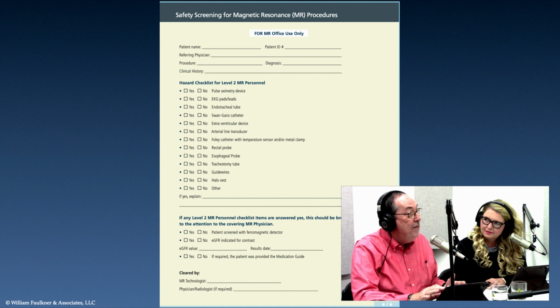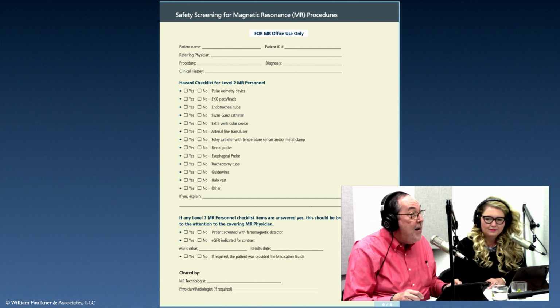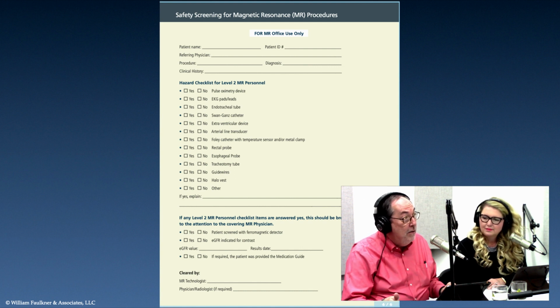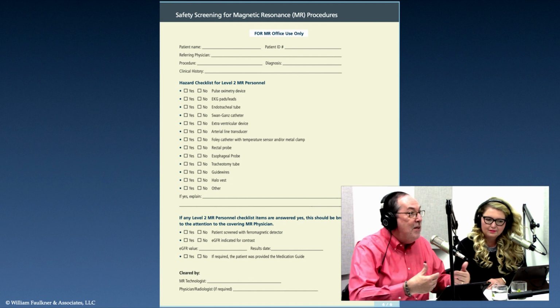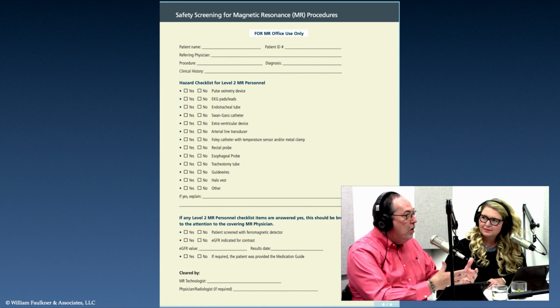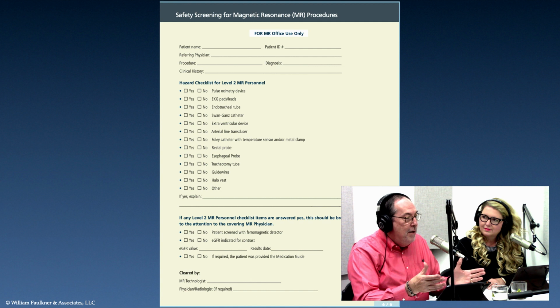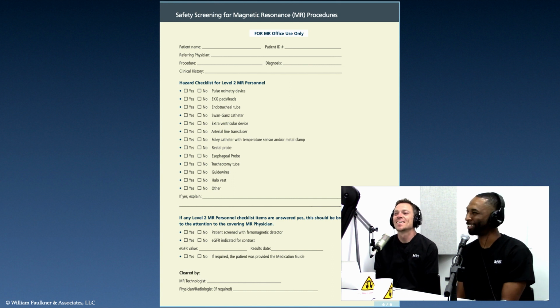This is not checking a box. This is an investigation. In fact, when I started MR in 1985, we referred to it as interviewing the patient. We didn't say screen the patient. It was interview the patient, because we sat down and interviewed them. We had this private little dressing room where you could sit down, look at the patient, and talk to them. Because if you've done MR long enough, you can look at somebody and know they're not telling you the truth.